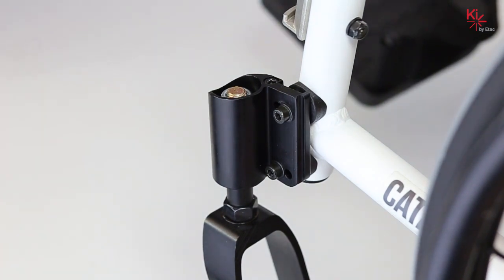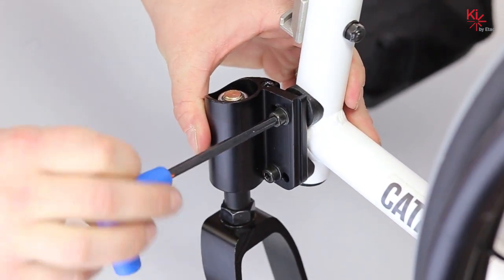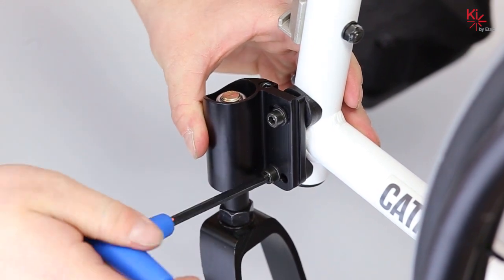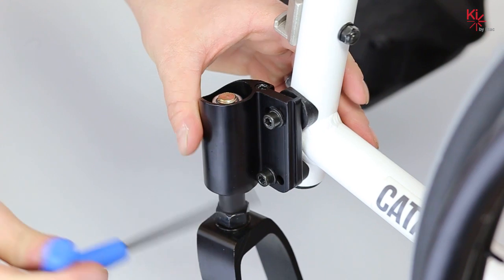Locate the two socket head bolts on the outside of the caster housing. Using your five millimeter allen key turn each screw two complete turns. By loosening these screws the system will now move freely for your next step.